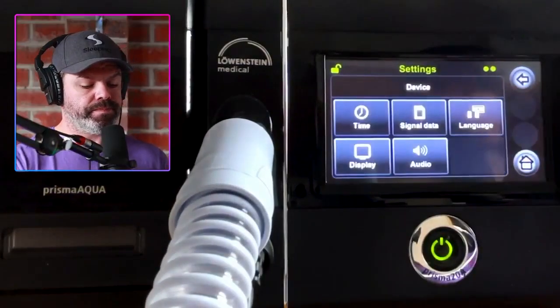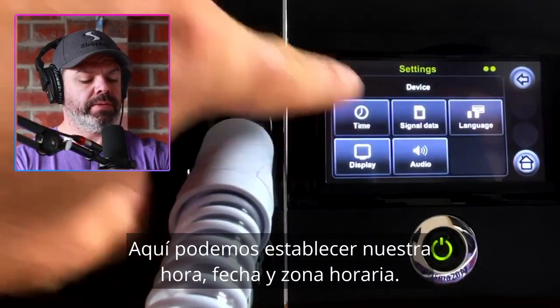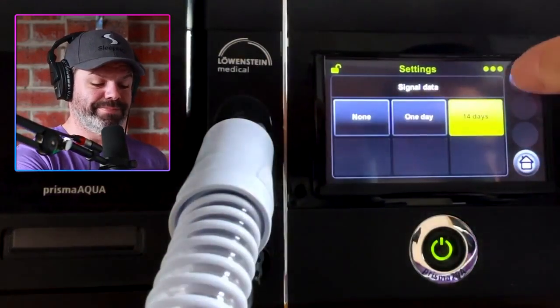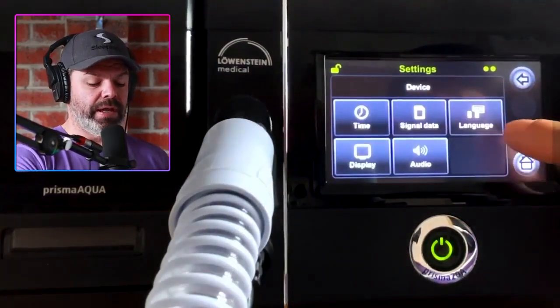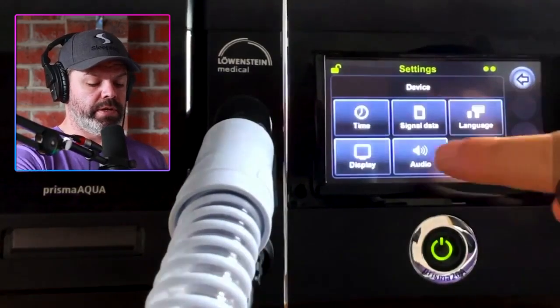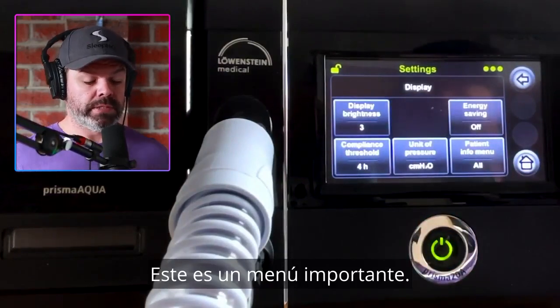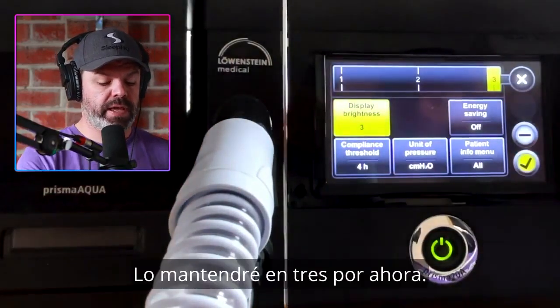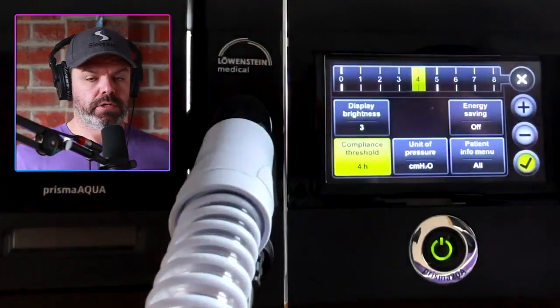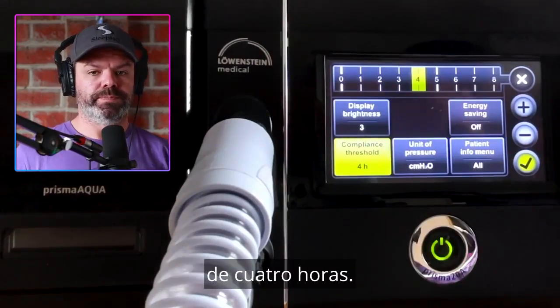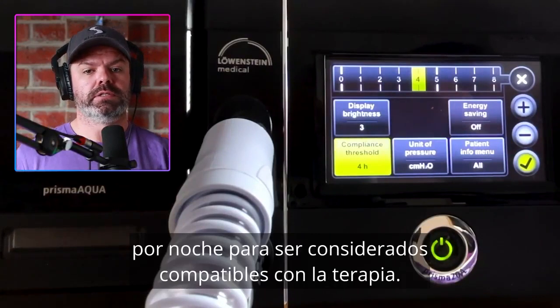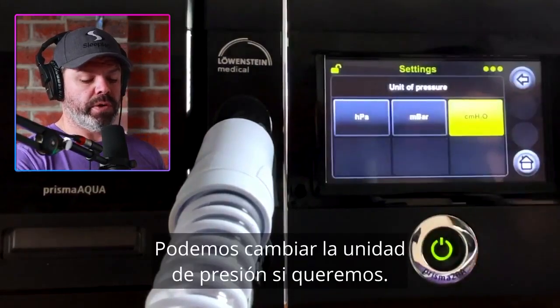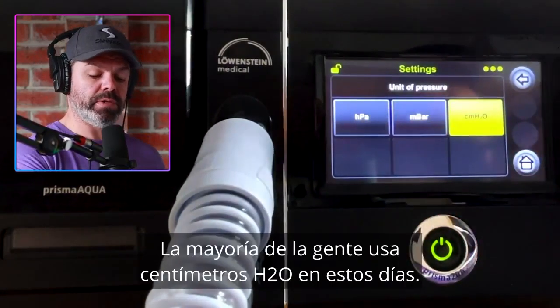Next we have device settings where we can set our time, date, and time zone. There's also signal data — I'm not entirely sure what that is; I'll get back to you on that one. Under display, we can change the brightness between one, two, and three. We can change our compliance threshold — most companies use four hours, meaning you need to use your machine four hours per night to be deemed compliant with therapy. We can also change the unit of pressure: HPA, mbar, or cmH2O — most people use cmH2O these days.